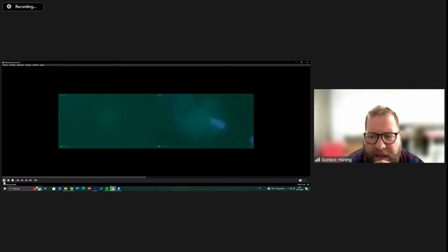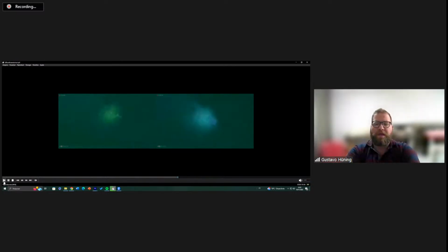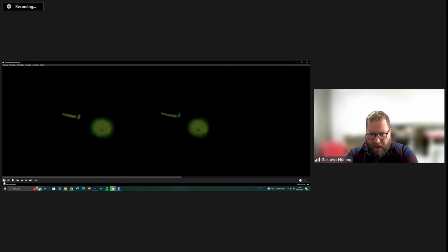One of the things I like about the barrier filter, especially when you have microaneurysms or smaller findings, is that you can see them with better resolution because you are enhancing the contrast. With the newer digital filters, we can see it better, just like here. On the left side it isn't that clear, or the definition, like in the edema, is not the same. And here we are playing, looking for different color spectrums.